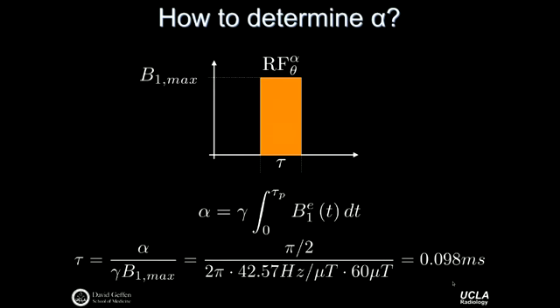So this gives you, I hope, some sense for the duration of RF pulses, the magnitudes of the fields that we use to excite spins for maybe a given flip angle. But you can see that if your gyromagnetic ratio is changing, you'd have to change your pulse parameters. You not only have to change the carrier frequency, we'll get to that later. That was the carrier frequency was like inside that Rect function, right? But you might also have to change the B1 amplitude or the duration so that you get the actual flip angle that you want.